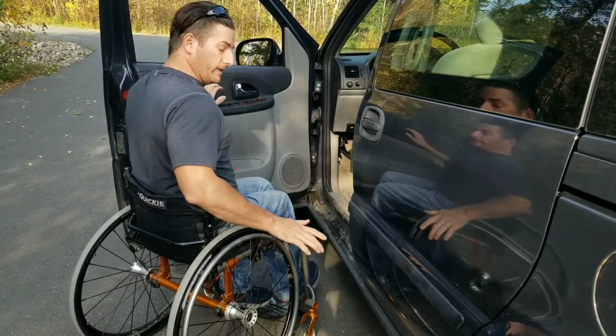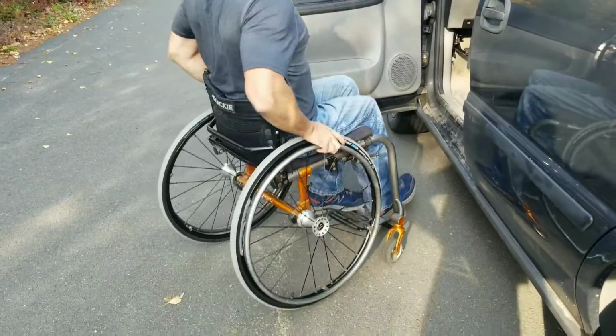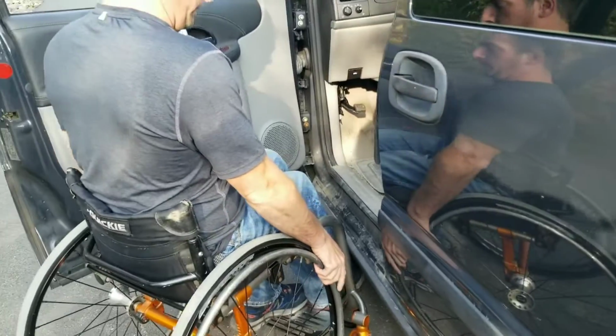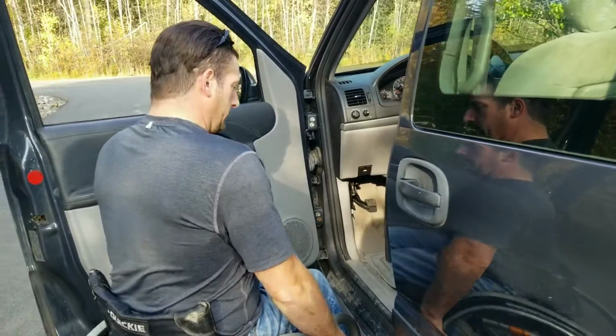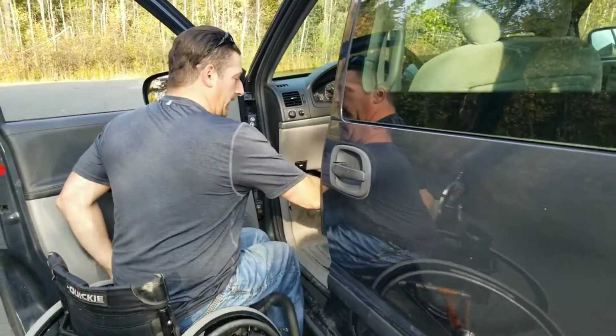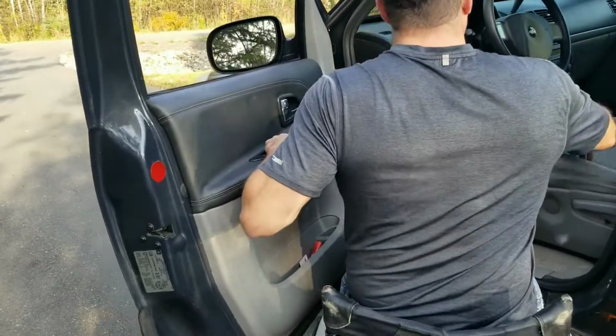Now I'm on a bit of a hill, a slant, so I'm going to put my brakes on, so I don't want my chair to roll away. Okay, so I'm putting my brakes on. Now it's all about the angle. Now this is a bit of a high hike, so you're really going to have to find a place to grab what's best for you.